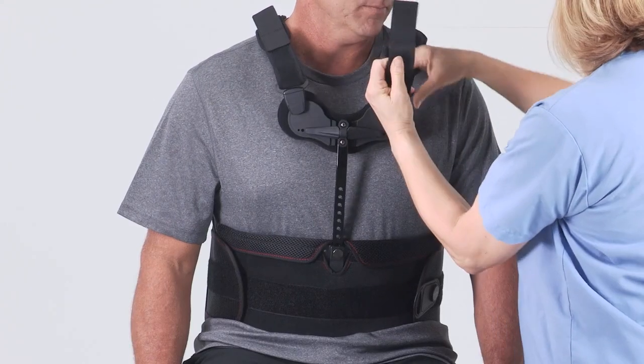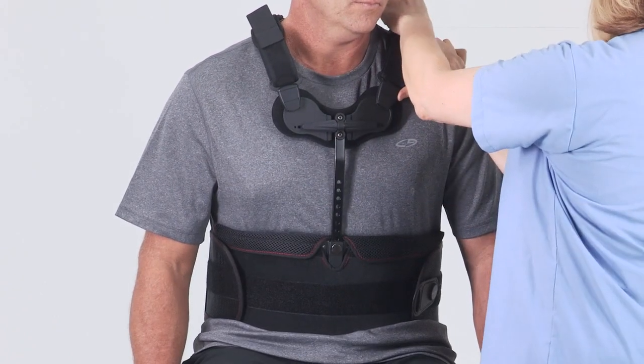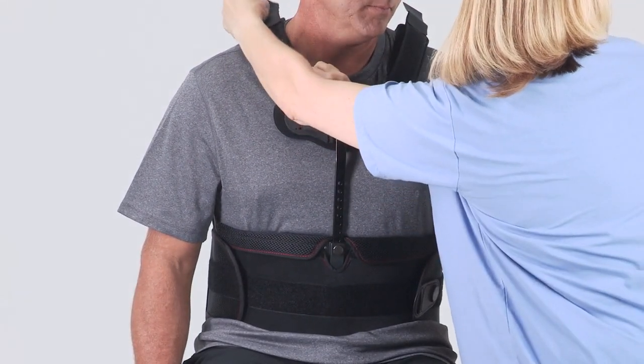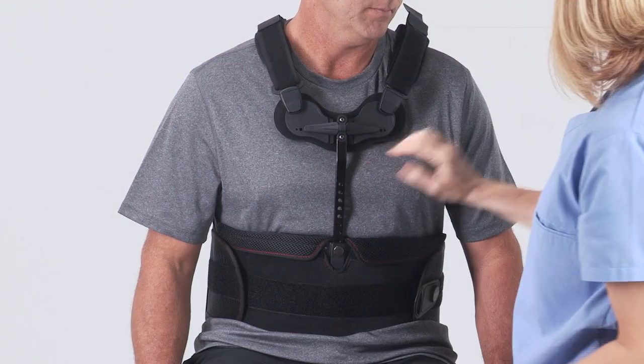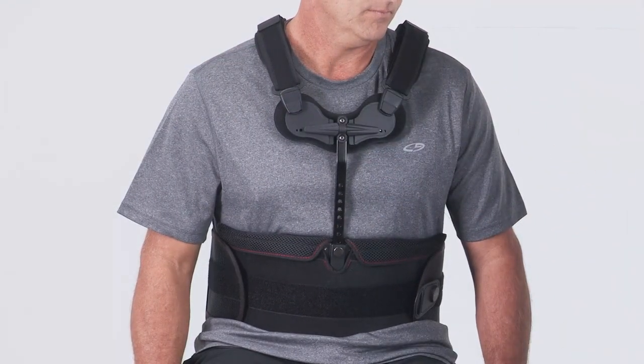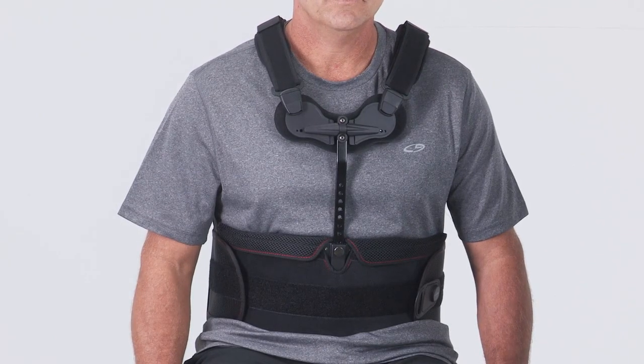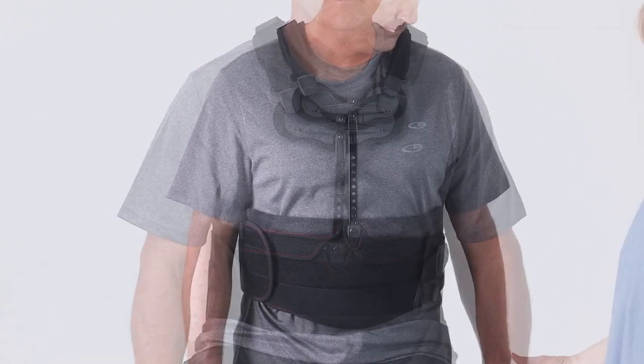Adjust the shoulder straps. Start by releasing and adjusting the back Velcro straps first and then adjust the front Velcro straps. Be sure to maintain the bottom edge of the front panel with the pubic bone and the back panel between shoulder blades and lower back.